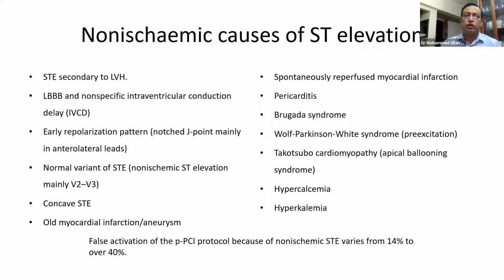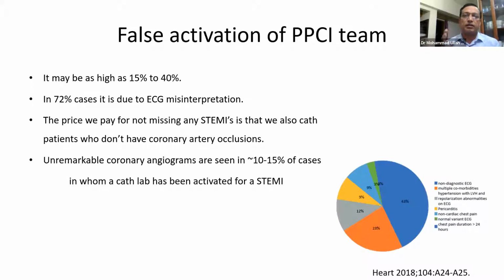And there are a number of non-ischemic causes of ST elevation. We should think about it. And these non-specific causes of ST elevation can lead to a false diagnosis of ST elevation MI. In fact, different registries have reported that the false activation of the primary PCI team is around 15 to 40%. And most of the time, it is because of the misinterpretation of the ECG. And this has a number of impacts on the patient's cost, hospital cost, the work schedule of the doctors and everything.